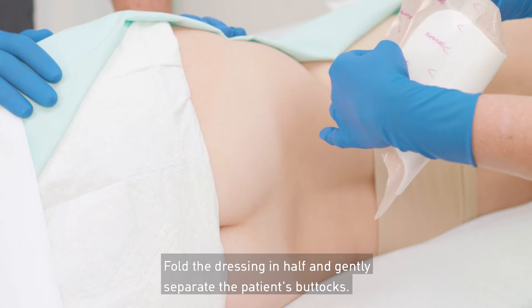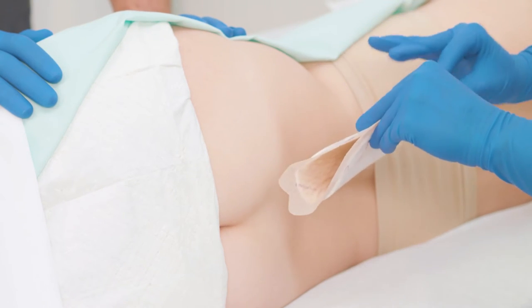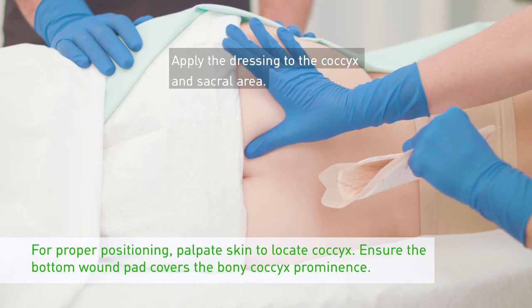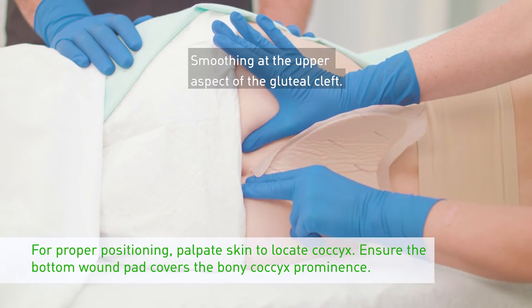Fold the dressing in half and gently separate the patient's buttocks. First, assess the patient's anatomy to determine the appropriate dressing positioning. Apply the dressing to the coccyx and sacral area, smoothing at the upper aspect of the gluteal cleft.